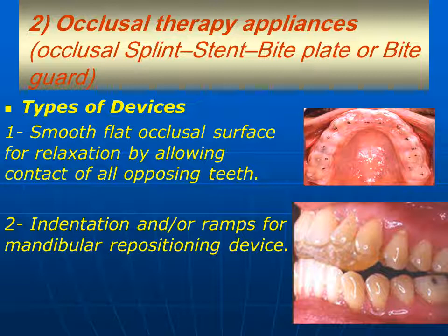Or we can use indentations or ramps if the appliance is used as a mandibular repositioning device to reposition the mandibular position. Therefore, we add indentations from the opposing occlusion or ramps to help closure in the exact needed position.